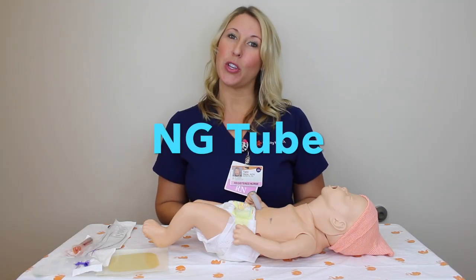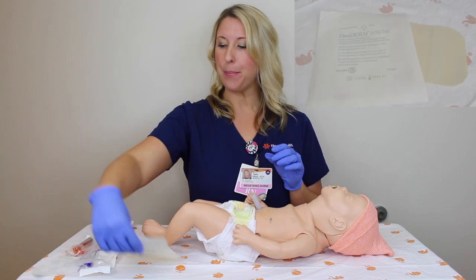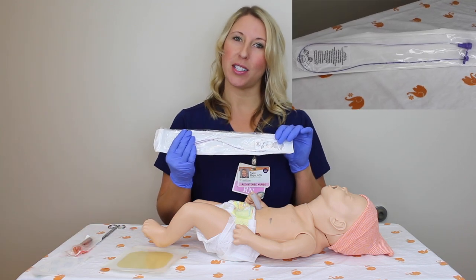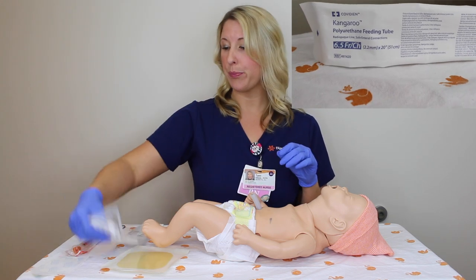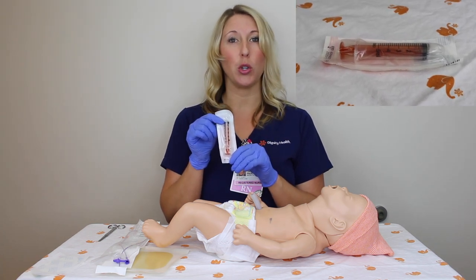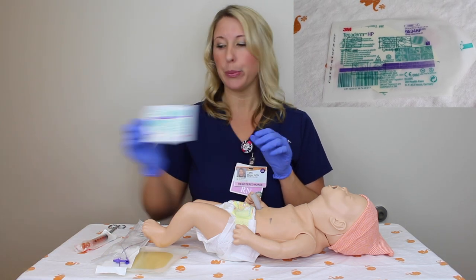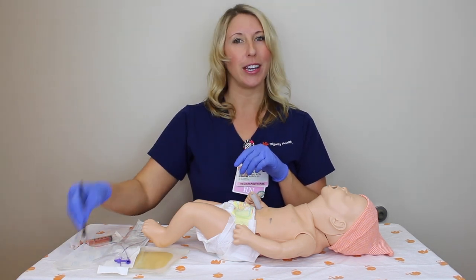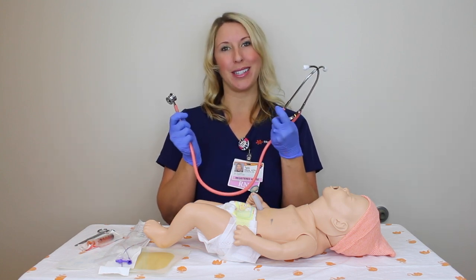To insert an NG tube, you will need Duoderm, which acts as a barrier protector for the skin, and the NG tube itself — make sure it is size appropriate for your baby. Today I'm going to use a 6.5 French, a BD syringe to verify placement once you are in, Tegaderm to secure the NG tube, scissors to cut your barrier protector and Tegaderm, and a stethoscope to confirm placement.